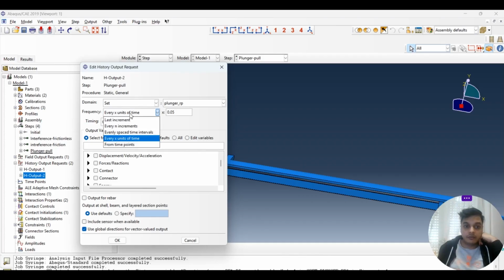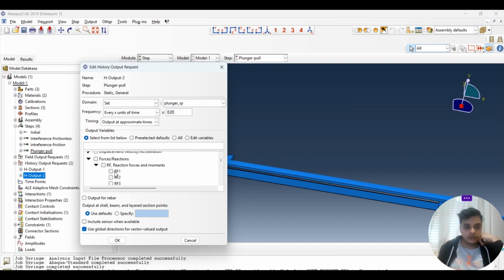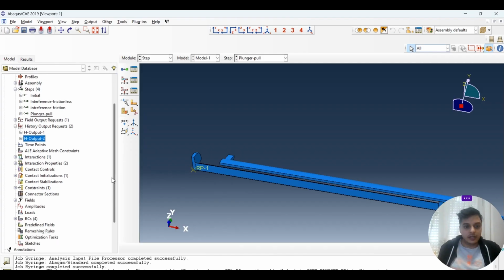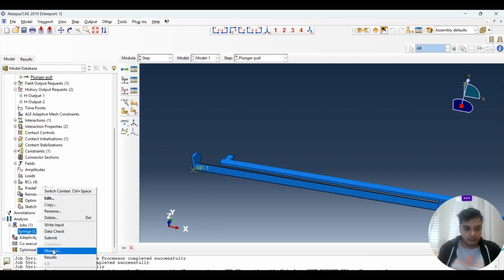And we define it for every x unit of time for this particular step. If you remember, we have defined the time interval, the time step for that plunger pull time step, and output at approximate times, and just simply go to the reaction forces here. On reaction forces, this is the force in the x direction for me, so I just click it and done it. So that's the three modifications I did, and after that everything was fine, and we got the complete analysis.